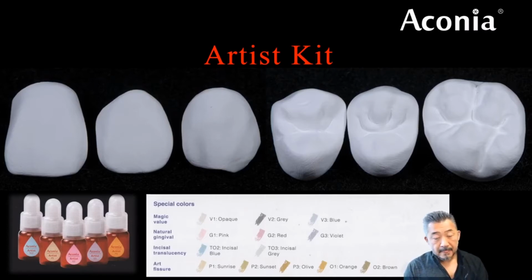I use a liquid called the Artist for the zirconia disc. The color variations are shown on the screen, but not all are used. I don't know how many variations there actually are, but not all are used. It depends on the case. Okay, let's see a video of how to use the liquid.